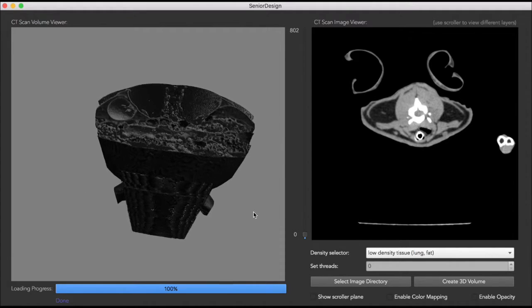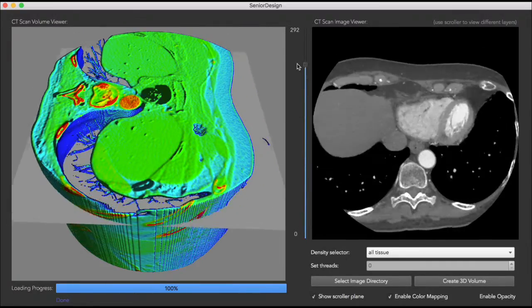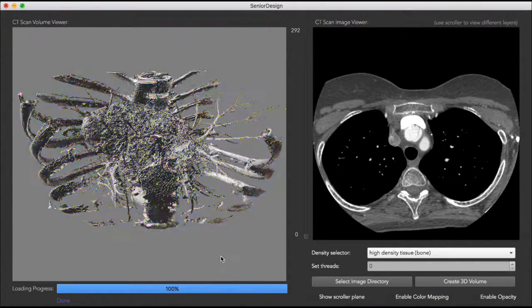So you can see on screen the different density selections being shown. And now here's another CT scan that I also volumized. This is of a heart and the chest cavity. You can see from the different renders the rib cage here and some of the spinal cord, as well as some other high density veins that have gotten included as well.